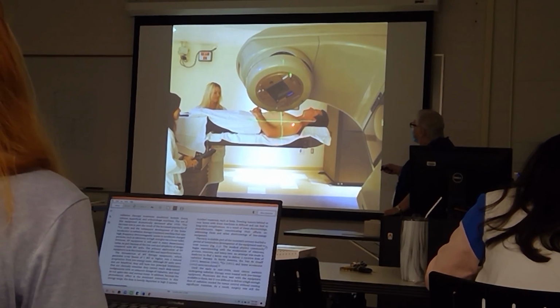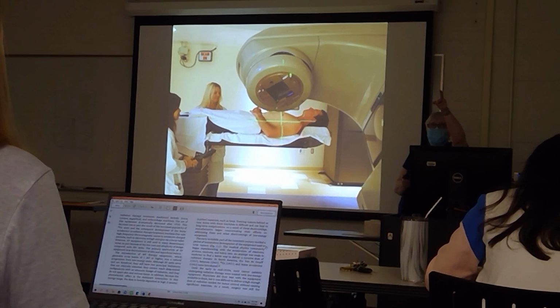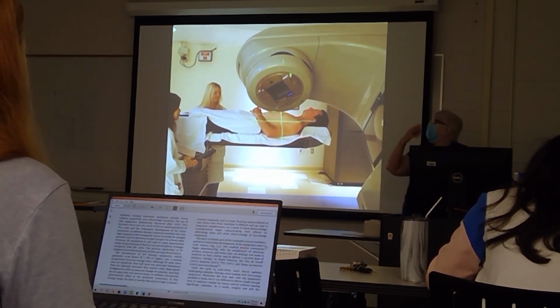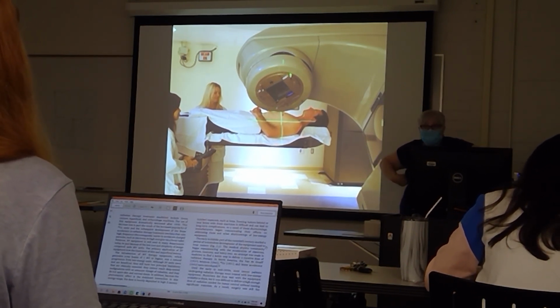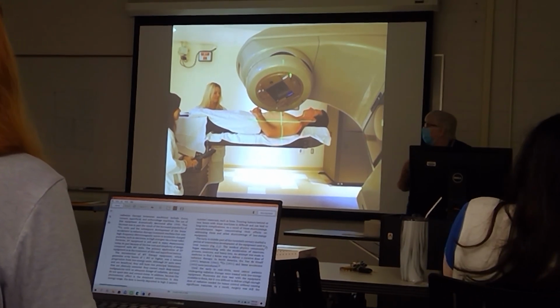So you had the lasers coming from the sides and from above. This sagittal, the anterior, which if the machine's at 0 is hidden, and then the lateral lasers, okay? So one from each side, and one from the top.